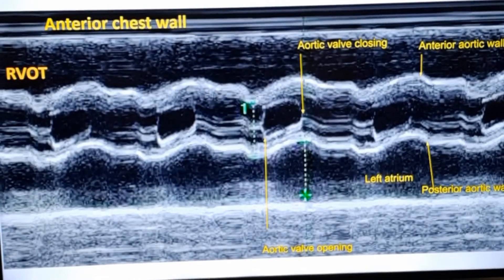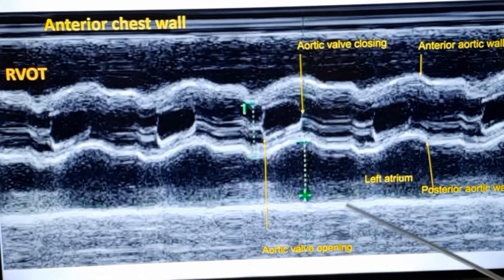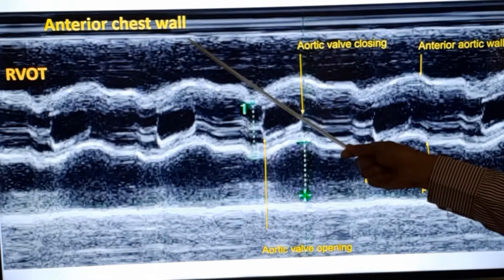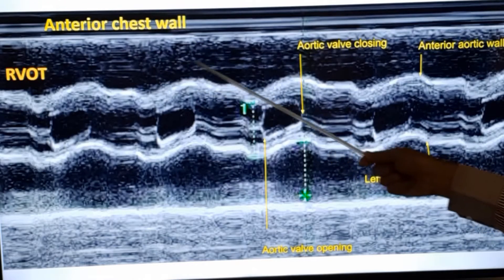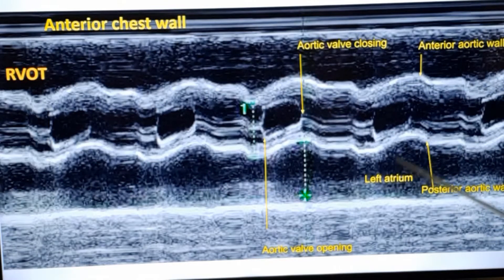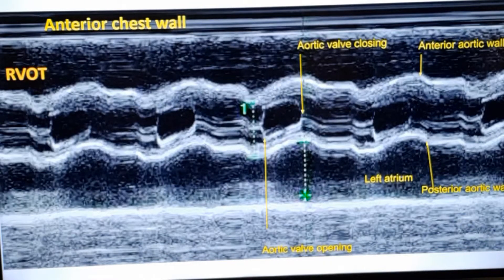This is the M-mode cut usually taken from the parasternal view. In this case you are not seeing the 2D image, you are seeing only the M-mode echocardiogram. This is the anterior chest wall, just below that is the right ventricular free wall and RVOT region. The horizontal axis is time, and the vertical axis is distance from the surface or the transducer.